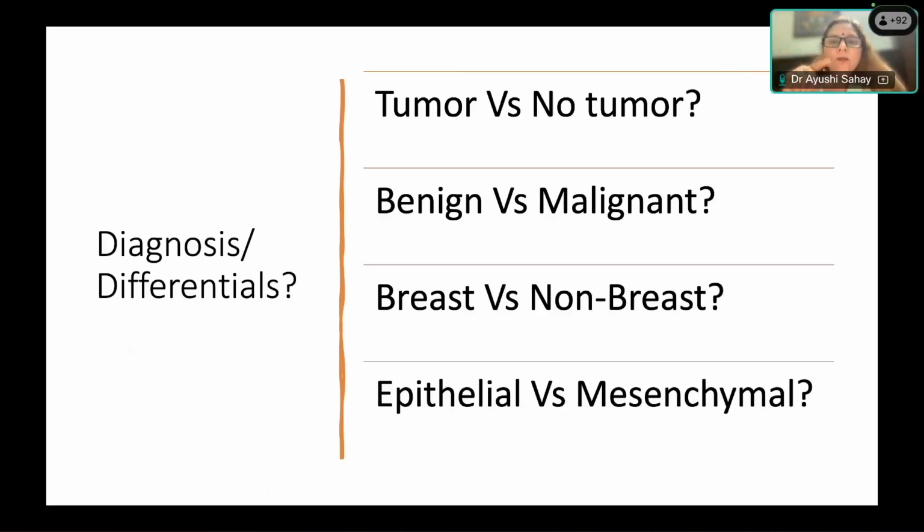So any other point you would like to add on the core biopsy? What else would you like to report? Besides that there is tumor, you would like to report on LCIS. Any other feature? Nottingham grading? Yes, you would like to report on the Nottingham grading and of course the biomarkers. Besides that, if you are seeing any LVI or PNI, any positive finding, you would like to include that. So these are the basic features that you have to report.